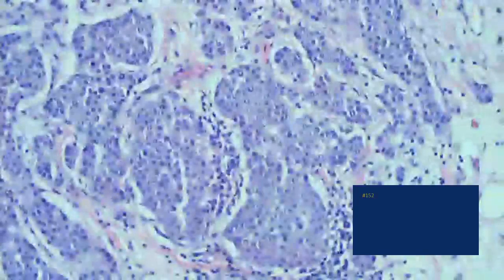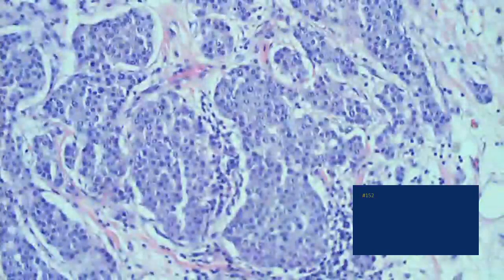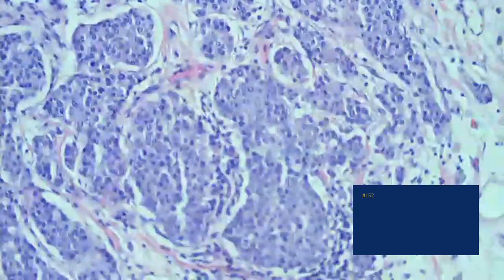Anyway, you can see that it is an epithelial neoplasm. So the differential diagnosis includes primary adnexal carcinomas, but you start looking at this, you see the cells really don't look like the typical small cuboidal monomorphous cells or things like a poroid hidradenoma or anything like that.